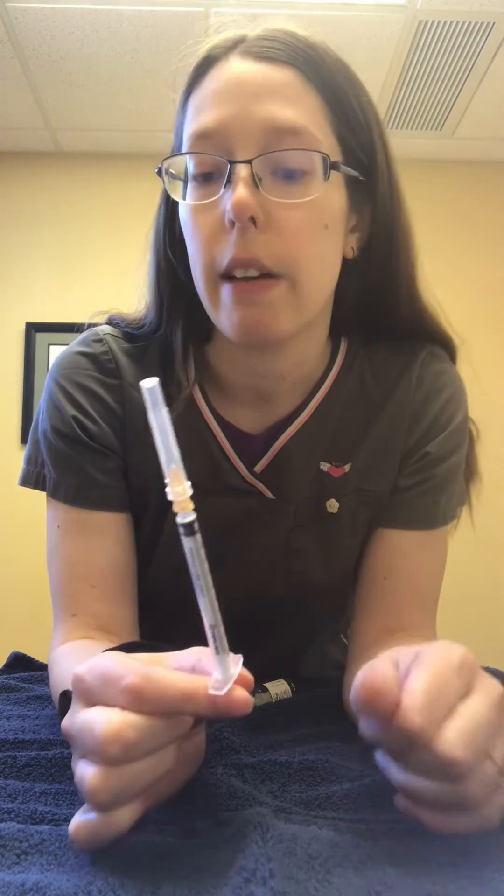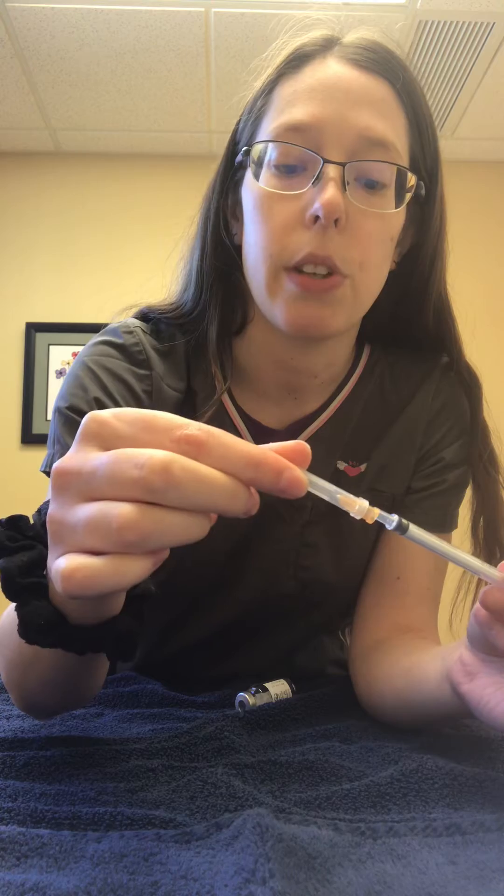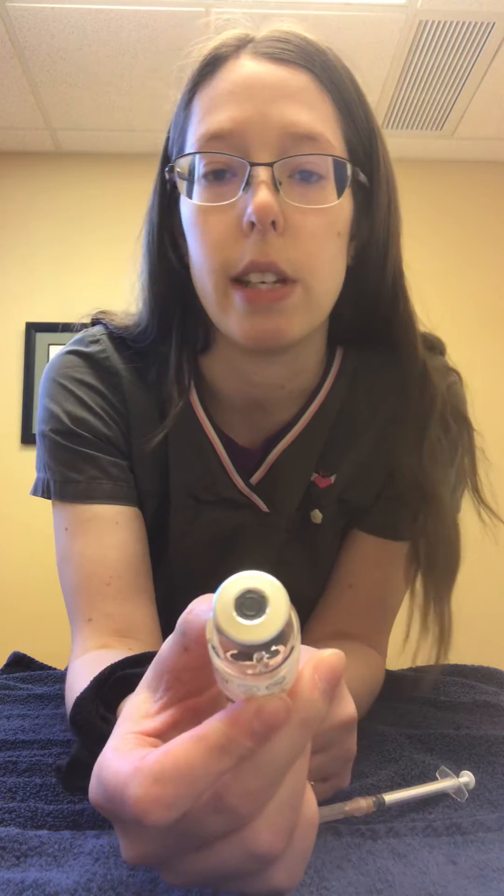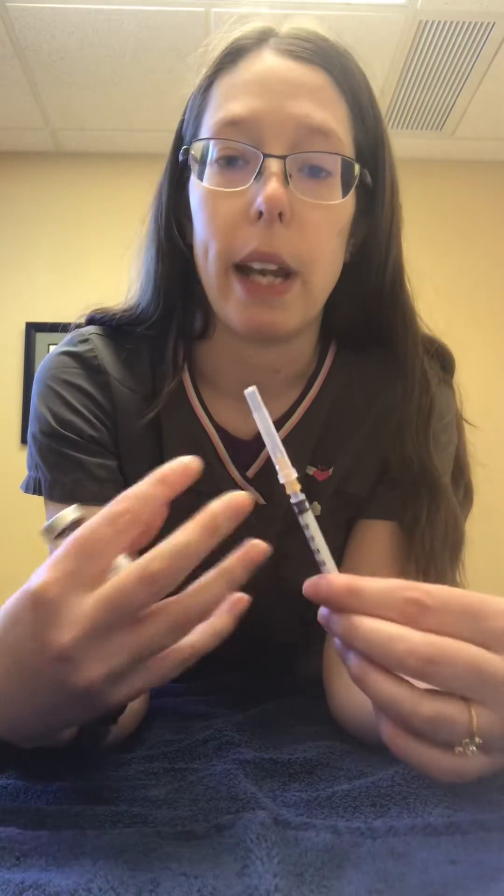Normally your injections, if you get them from us, will already be drawn up for you into a syringe that looks like this. If we've already drawn them up for you and gave you extra needles, you might want to put a new one on so that you have a fresh sharp needle. The one that's on there might be the one we used to draw the medication up with, so it would have punctured the rubber seal which kind of dulls the needle a little bit. So if we gave you extra needles, go ahead and change it to a fresh one before you give the injection. If we did not give you extra needles, then we put a new one on before we gave them to you.